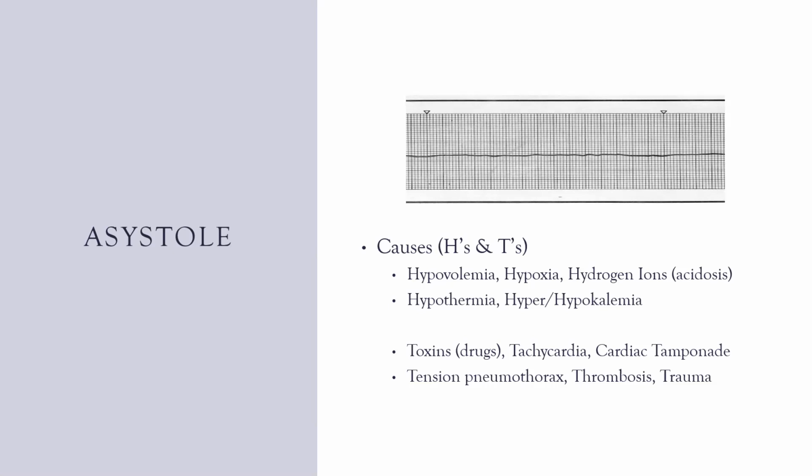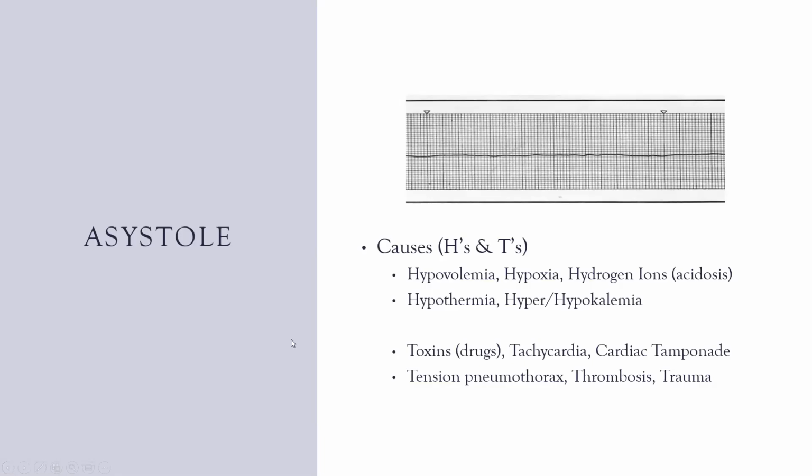Asystole has to be treated. Okay, you have to treat the cause of asystole, or asystole is just going to happen over and over again. And unfortunately, this is not Grey's Anatomy, this is real life. So we do not defibrillate this.